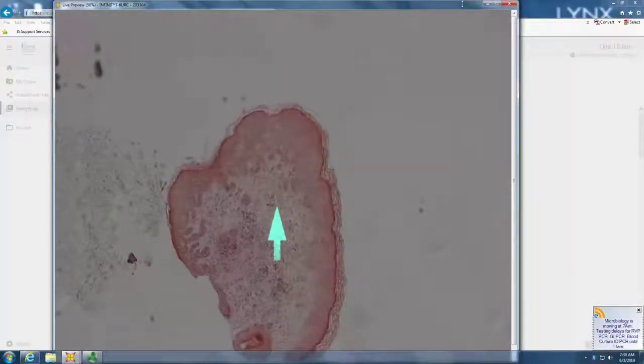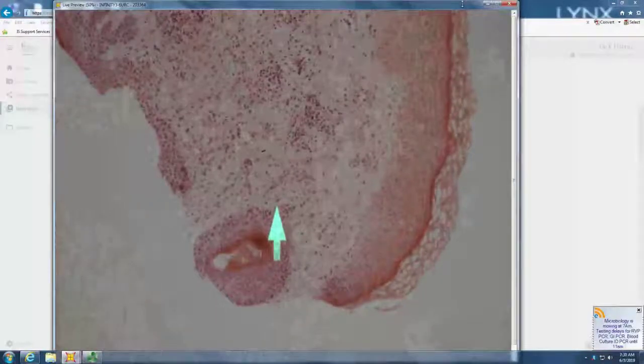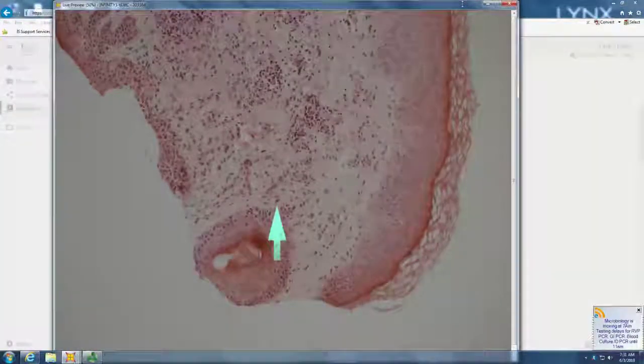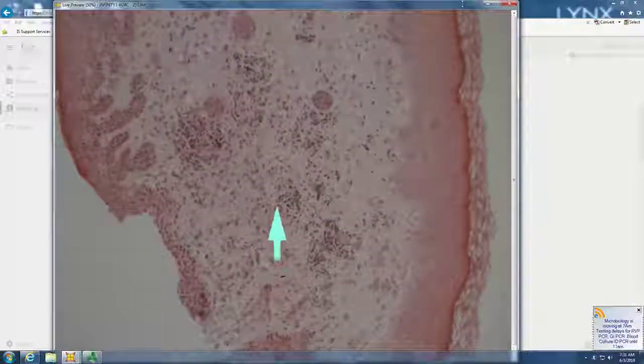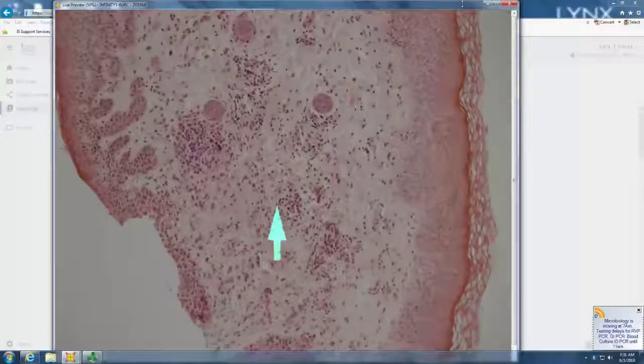Okay, that's what you get. Right? We just read them. We don't always control what we get in the lab. So, I think there's probably a little papule. Little papule, or at least they gave you a little piece.